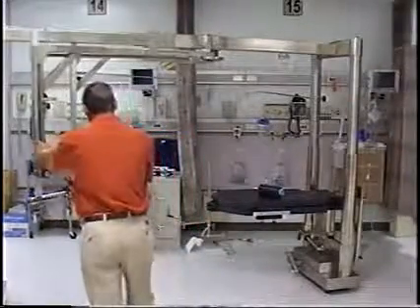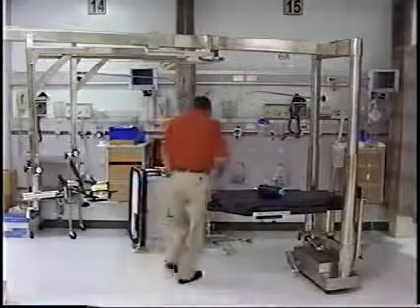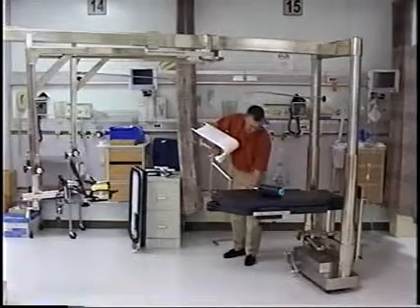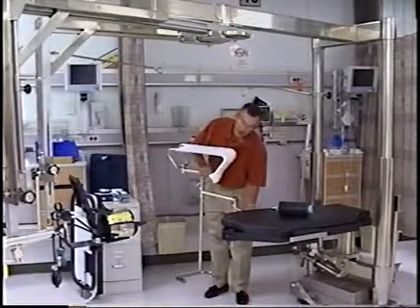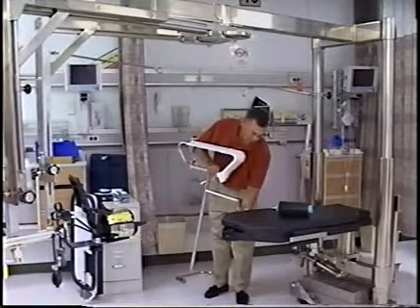Okay, so we've got a left traction cuff. We're going to put our well leg support in. I've got a lot of good friends who work for Steris, so I tease you about it, but they make good equipment.